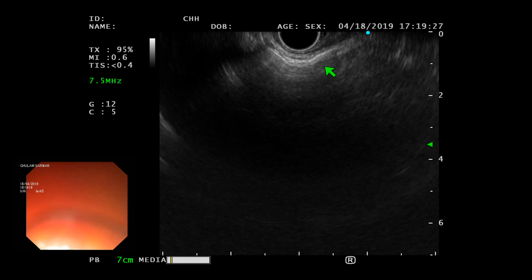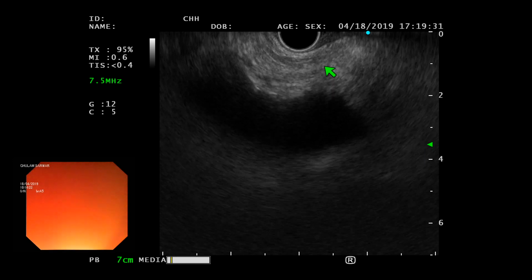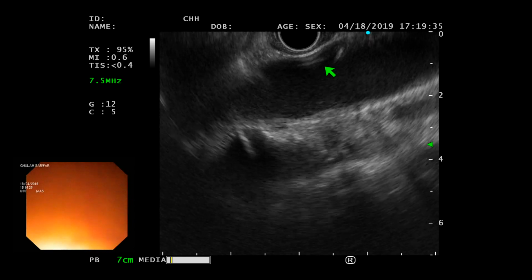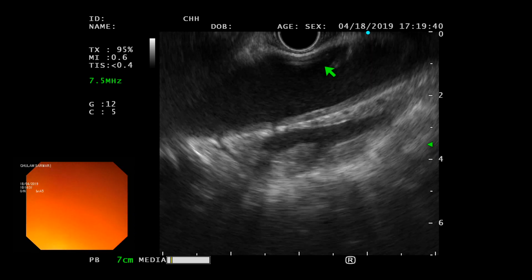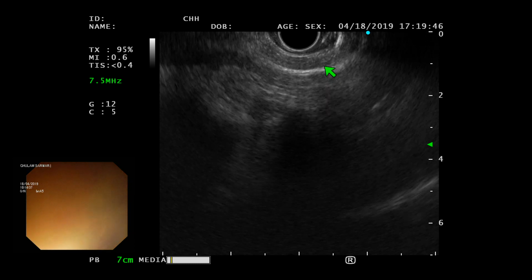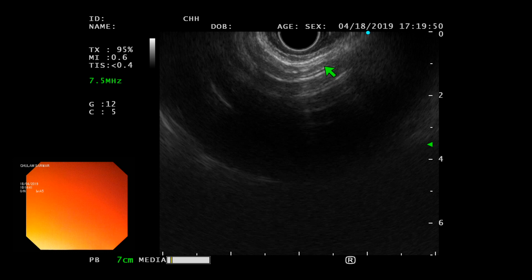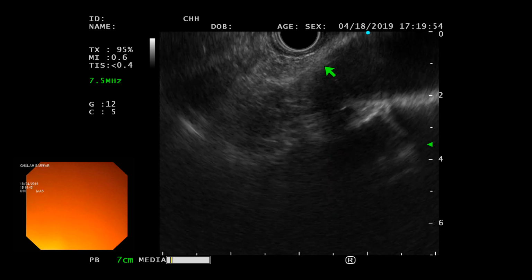From there, you have to rotate further to the right. Keep going. You see, you did not adjust your wheel just like the last time. So now you adjusted. Good job. So big wheel a little bit away from you. Now the aorta, no, it's okay. Just calm down. You lost it. You are pulling too much. Relax. Don't move it too much.